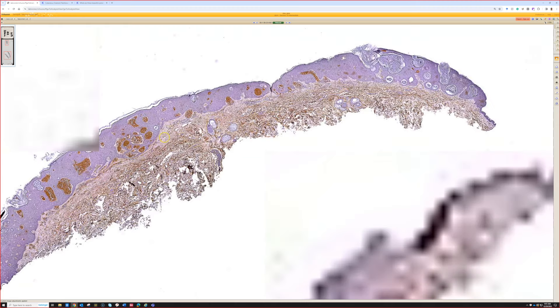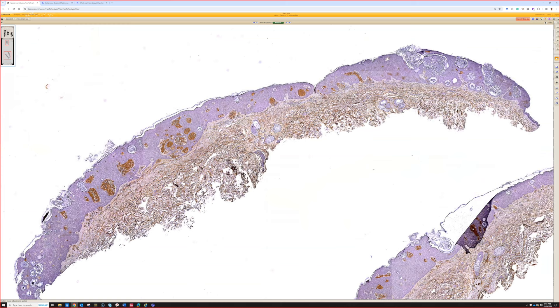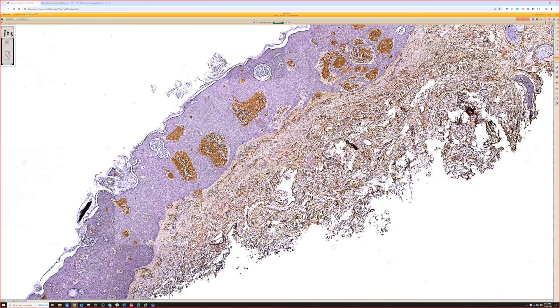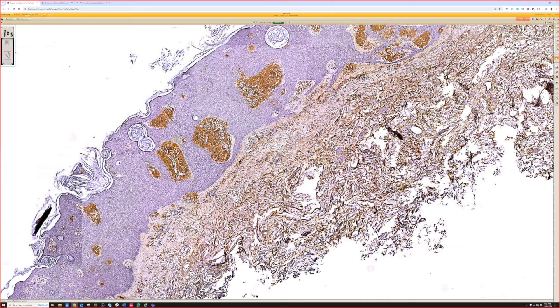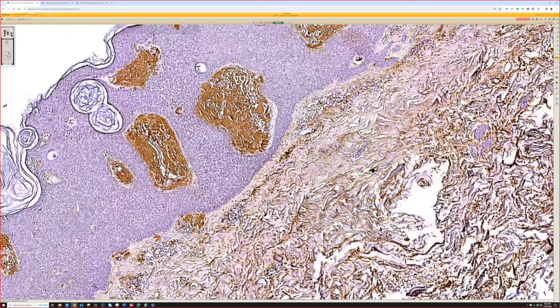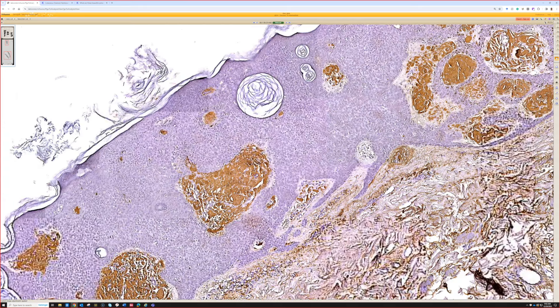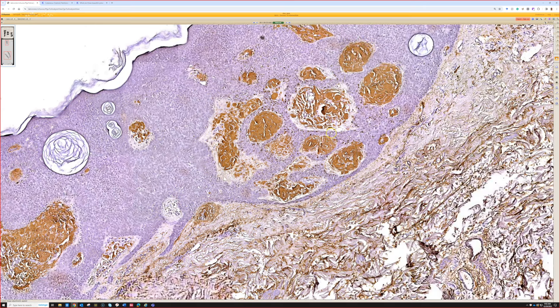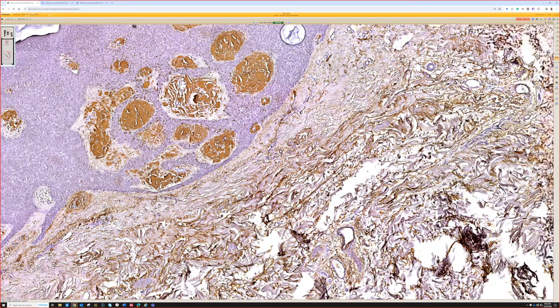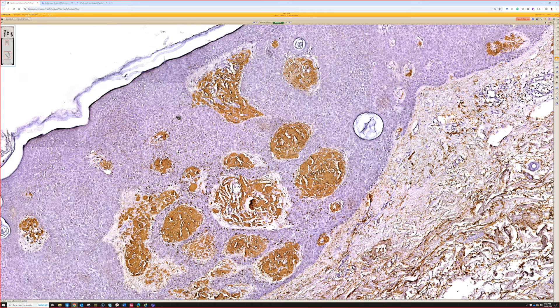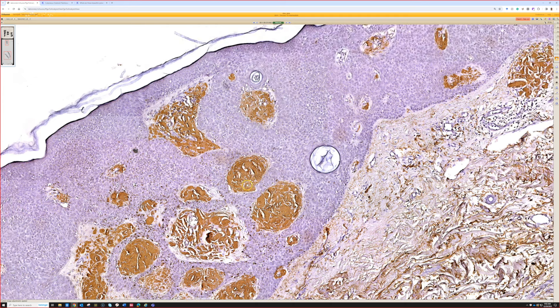We're going to look at a stain that's really nice. As I mentioned in the macular amyloid section, there are different stains you can do for amyloids. This stain is for amyloid P — amyloid P protein — and I believe it's actually an immunostain. I have tried it and found it a little difficult to interpret. There is also Congo red, and some people use crystal violet, though I have no experience with that.